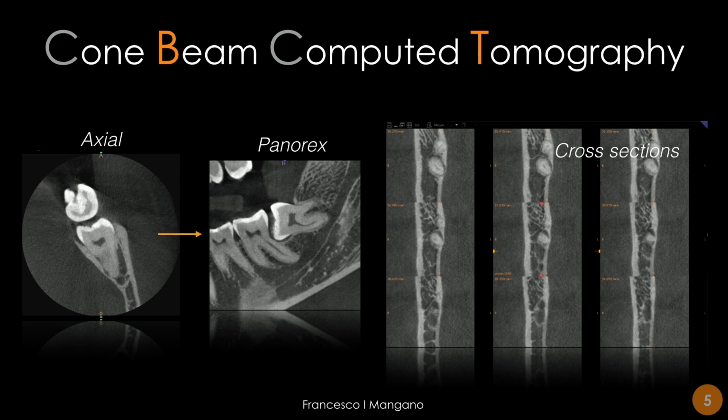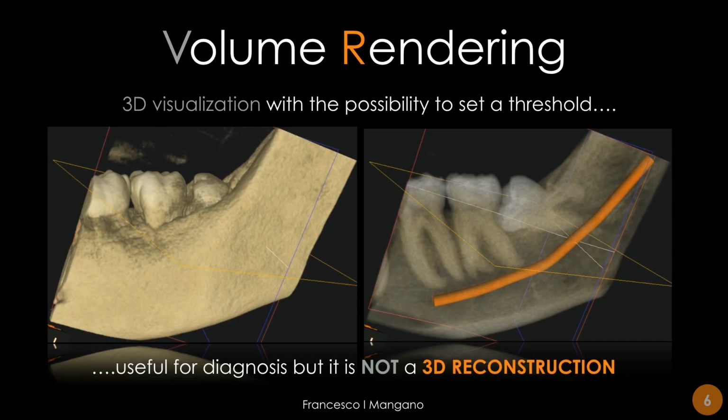This is a very good diagnosis, and this has also an impact on the final treatment because the surgery will proceed accordingly, according to this risk, according to the anatomical consideration. But this is only partial. It's a possibility to use the CBCT as a diagnostic tool, but we can use the DICOM file also differently. We can use the DICOM file in order to change our treatments.